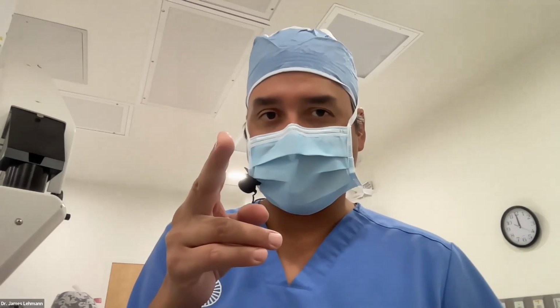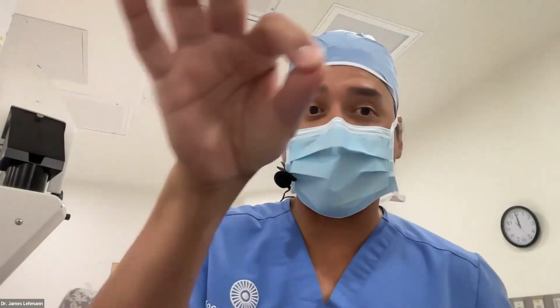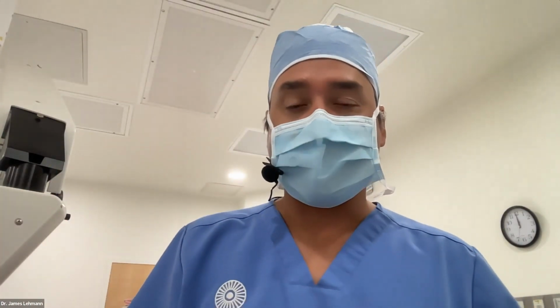What you have to do is you have to go in and cut and free up a leaflet so that you've got a lip, and then you re-grab with the utrata on each side of that cut and enlarge it. But it's tricky, and you can sometimes get into trouble with that. But that's what you have to do.